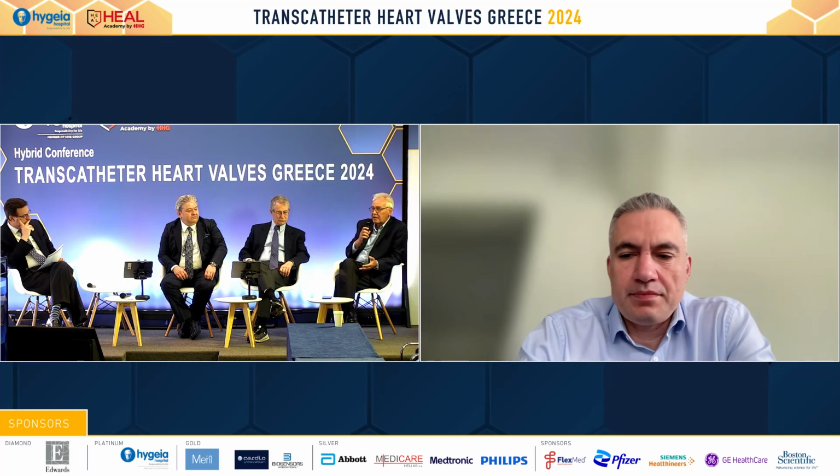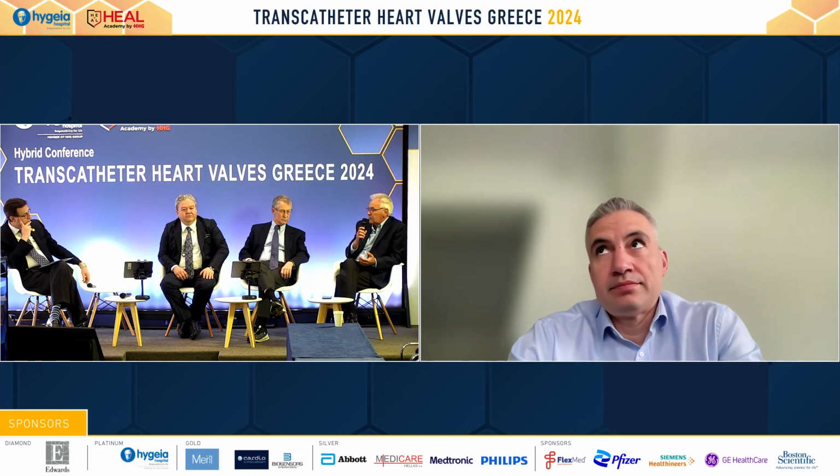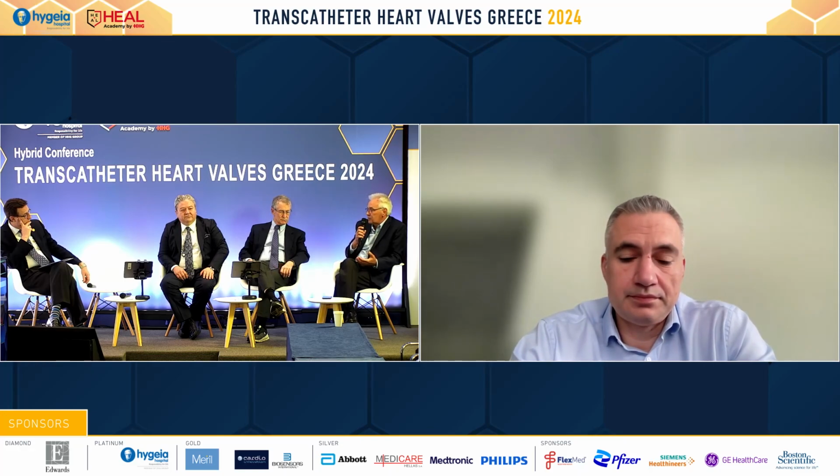As a surgeon, I know very well that there is not a circular annulus in every patient. There are so many differences between the patients that cannot be known before the operation, before any TAVI: the coronary alignment, the annulus alignment, and the leaflets. So the problem remains: if you're doing younger patients, you will see more problems, as we saw there are problems in open heart surgery. But the future is that if you are doing younger patients, you will also see coronary artery disease, and the second operation will be much, much more difficult than the first operation, TAVI, in these patients. This is my opinion.